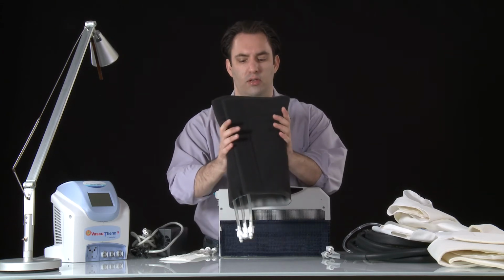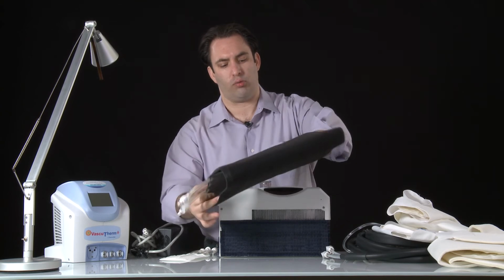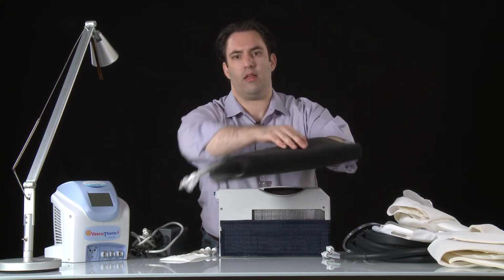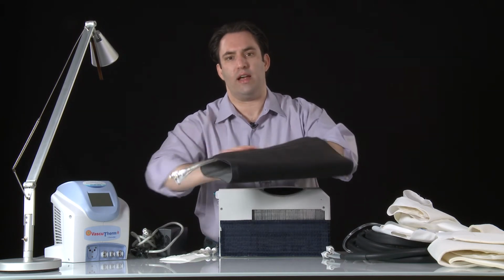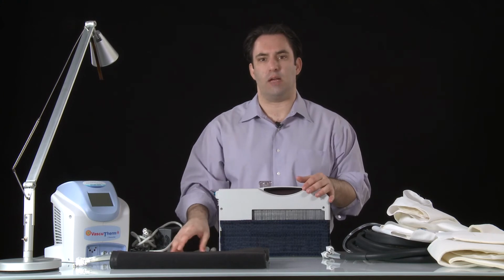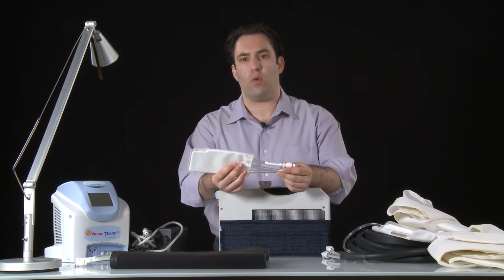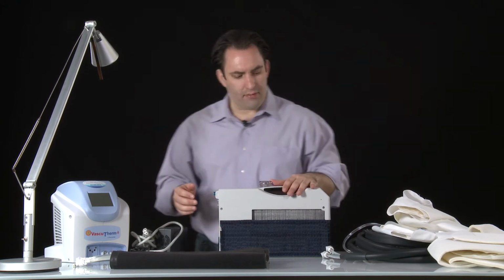This is another sort of example. I'm going to leave that closed for the visual, but the idea is that this is what you would call a circumferential wrap, and there's a treatment area that goes all the way around the knee. This would typically be a knee. The whole thing will compress, and it's pretty cool as well. It's a lot of material, but it can be very good for certain types of knee injuries. There are smaller wraps as well. It can be used on a wrist and so forth. And this is just one avenue.